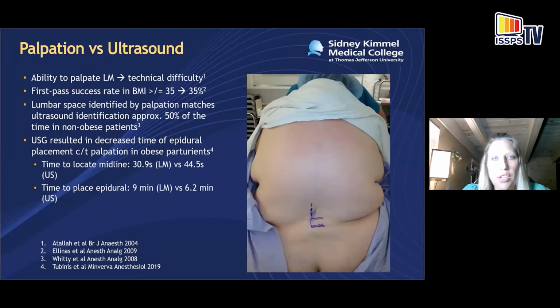In terms of palpation, there was a study in obstetric patients where they looked at the vertebral level and found that it was correctly identified by palpation in only 55% of patients when compared to ultrasound. And in most cases, the presumed level identified by palpation was at least one level higher than the anesthesiologist thought, thus potentially setting up the patients for neurological complications. So if we're only identifying the correct space via palpation in the non-obese patient half of the time, the likelihood of being accurate in the obese patient, where bony landmarks are rarely palpated, is very low.